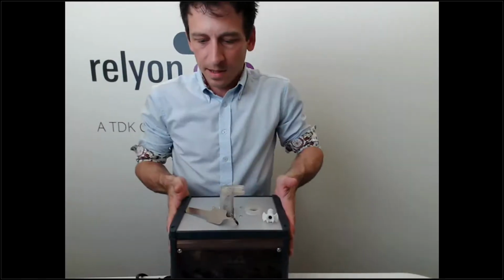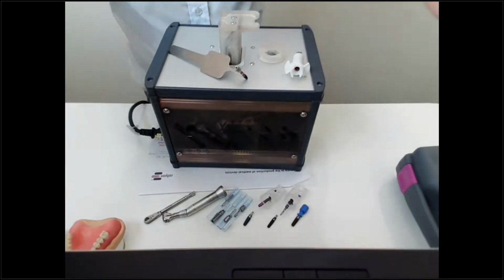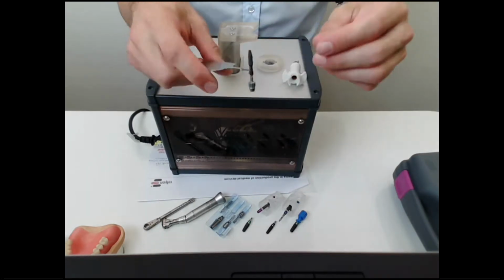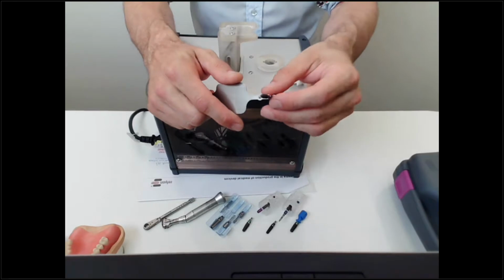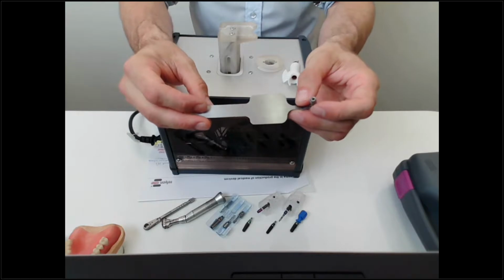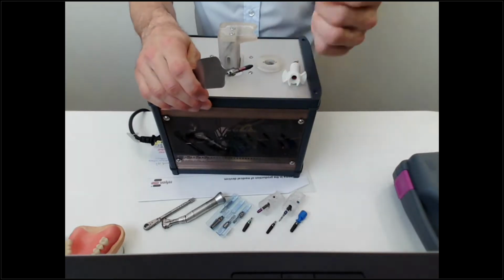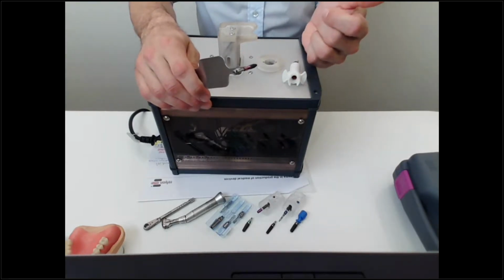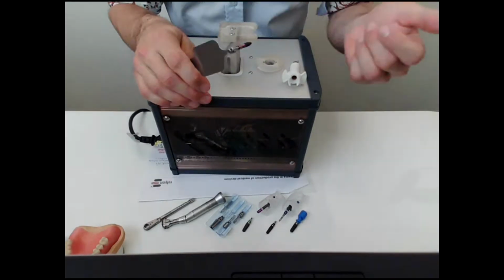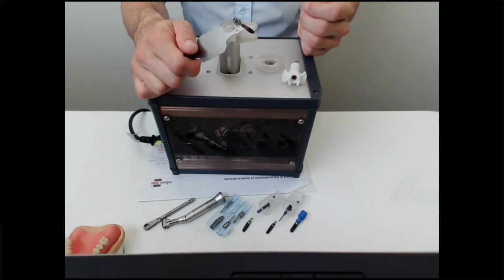So here you see our demonstrator, and now we'll demonstrate how it should work. I think the implant will be unpacked as usual, and we developed this prototype of the transfer tool, which can be attached to mainly all available implants, as it is possible to attach it to the RA shaft, for instance, which is available for nearly every implant system we know so far. Here we have a lot of different tools and implants, mostly from Camlog, which is a partner for us today.